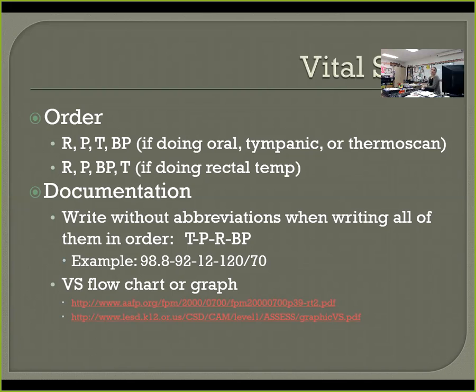So as long as you're doing an oral temperature, tympanic, or a scanning temperature, then you check respirations first, then pulse. A lot of times you can do those at the same time. Then temperature, and then blood pressure. Even though blood pressure is not really super invasive, it's definitely usually uncomfortable. If you're doing a rectal temperature, so on a baby, then you would do your rectal temp last. Obviously, that's going to be more invasive than any of the rest of them.